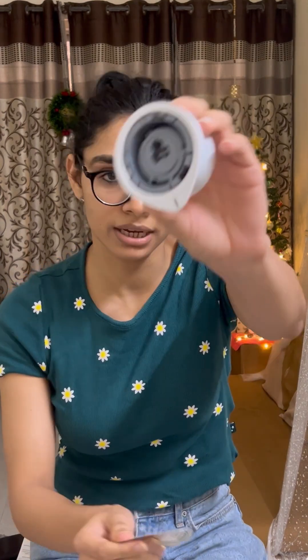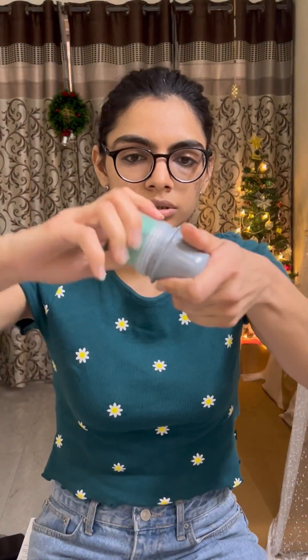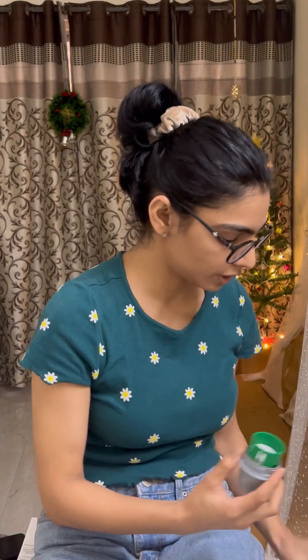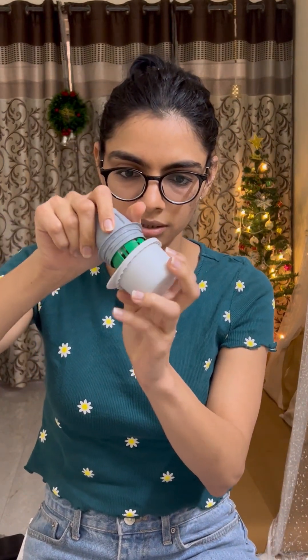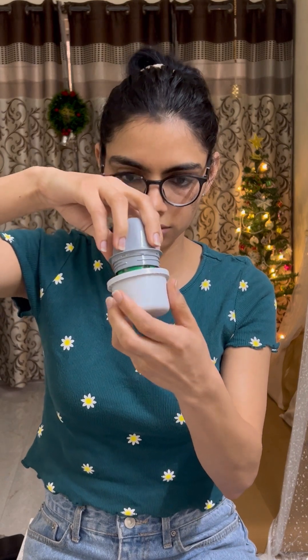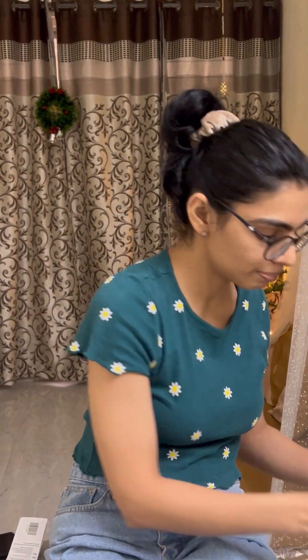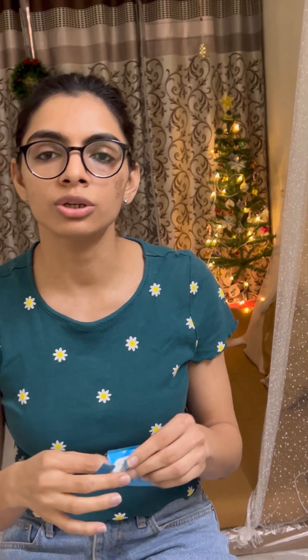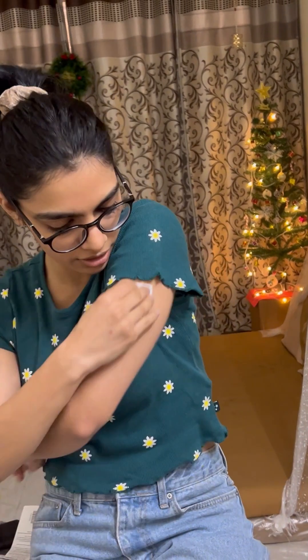I have opened this — this is the sensor. I'll be putting the applicator to the sensor. You can do it like this. I'll quickly clean the application site. You can use an alcohol swab for this, or you can clean it with soap and pat it dry.